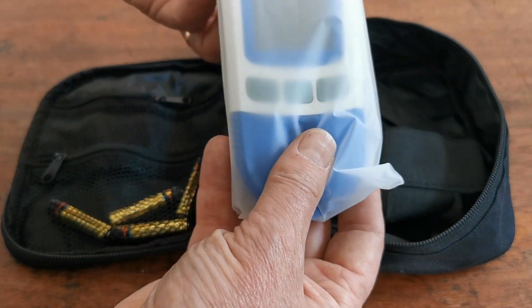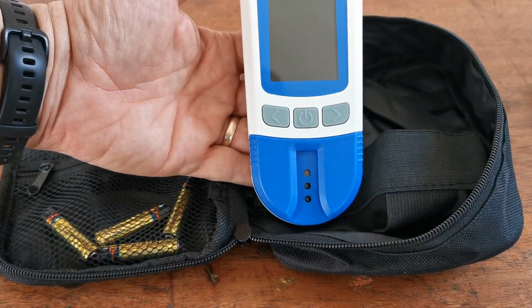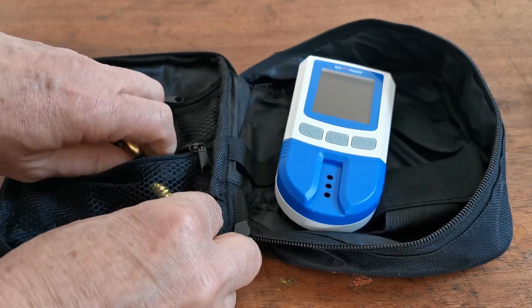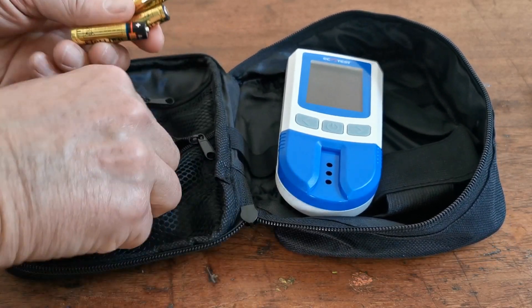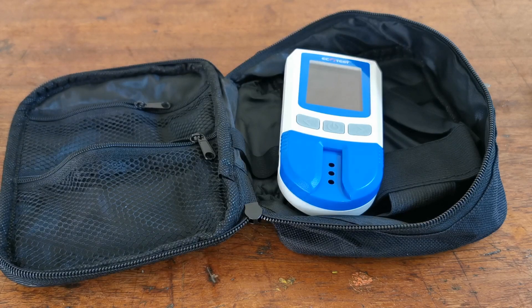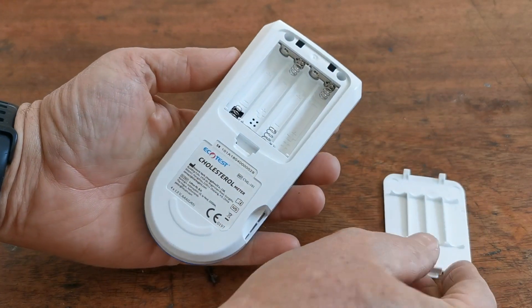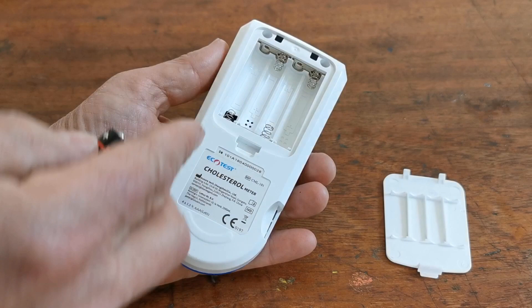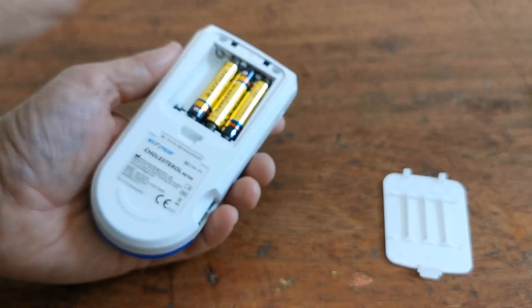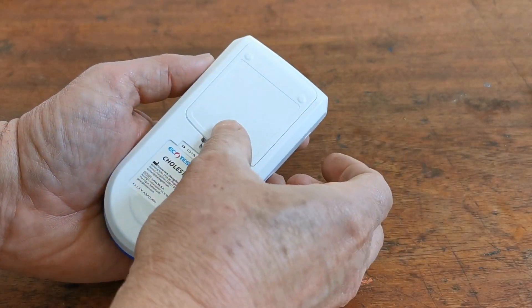Also included is the digital meter. Let's take that out of its protective wrapper — here you have the EcoTest branded blue cholesterol meter. The battery port is on the rear of this, and you will also be supplied as part of the contents of the pack four AAA batteries to power this unit. Simply open up the battery port and you have diagrammatic instructions showing how to insert the battery alignment. Follow this with the four batteries supplied, and when you put the last battery in place you should hear the meter beep — then pop the battery cover back on.